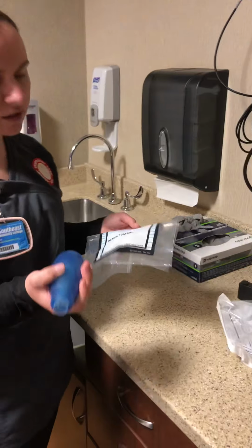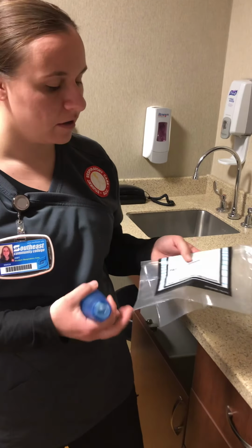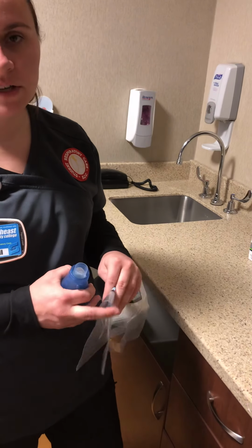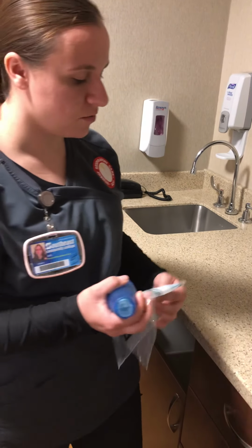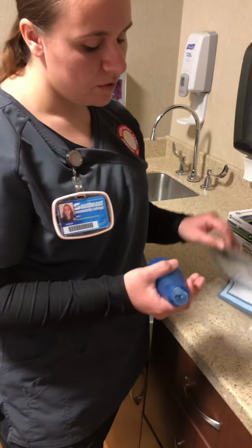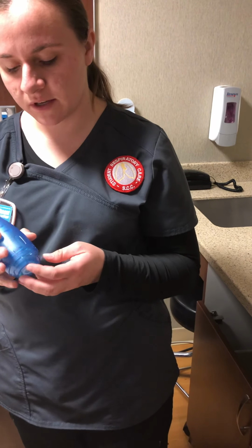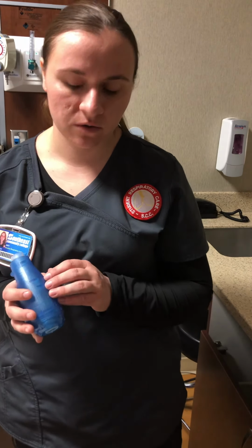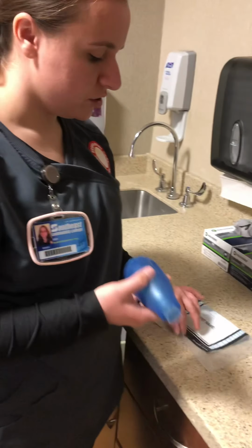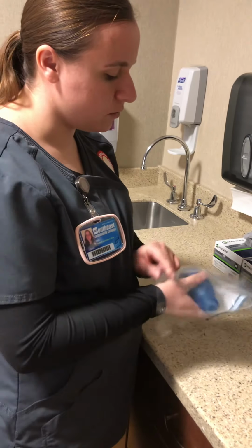This is a device that they can take home with them. That way they can continue to practice at home to keep their lungs open, especially if they have to do nebulizer treatments, anything like that. With this, you can hook up a nebulizer, but you don't want to, because the particles from the nebulizer medication can get clumped up in there, and you can't take this machine apart to clean it. You can only wash the mouthpiece. So I'll place it into their appropriate bag, that way they can take it home with them.